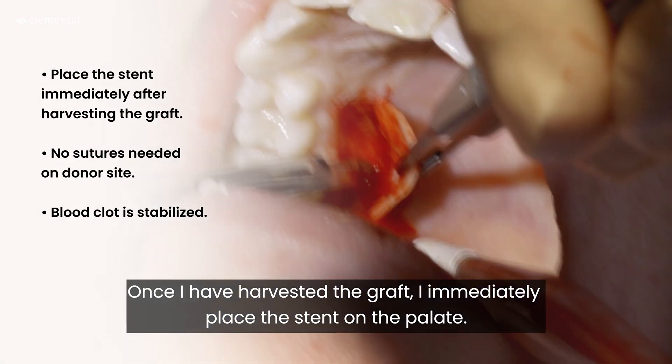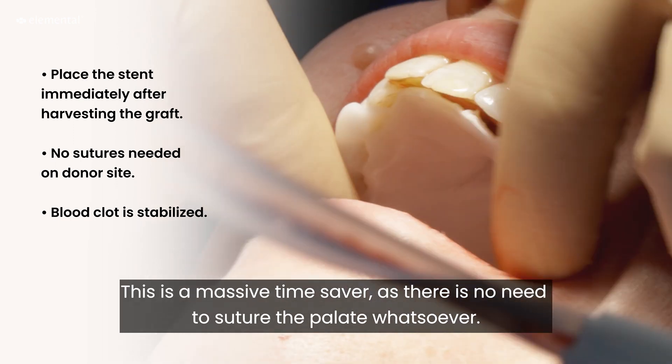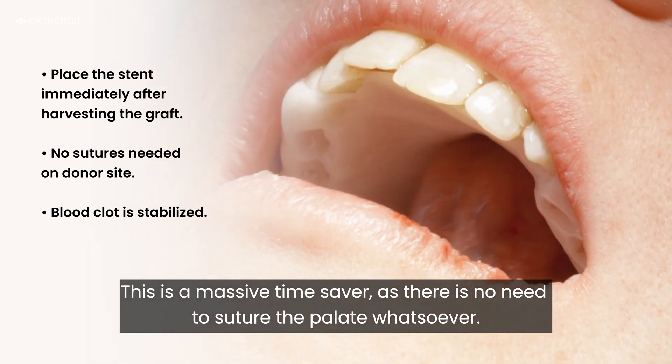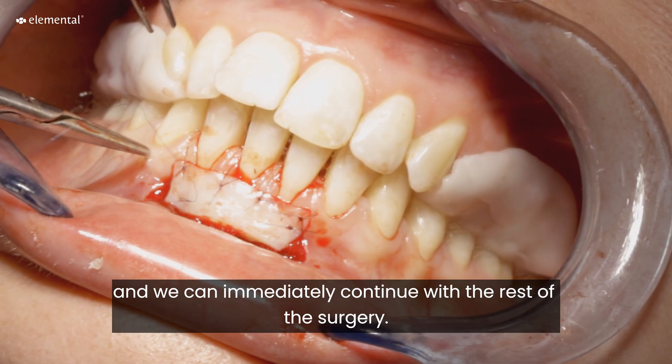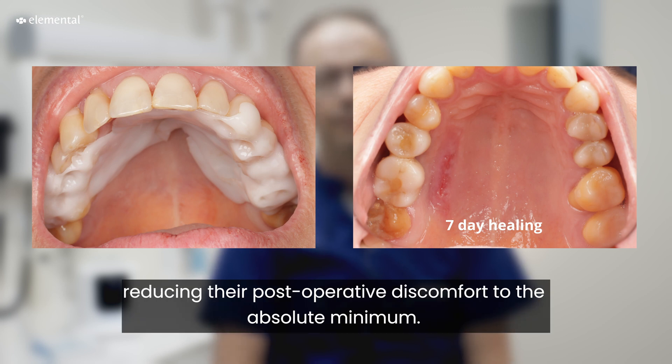Once I have harvested the graft I immediately place the stent on the palate. This is a massive time saver as there is no need to suture the palate whatsoever — the blood clot is stabilized and we can immediately go on with the rest of the surgery. Lastly, the patient will wear this stent for another week, reducing their post-operative discomfort to the absolute minimum.